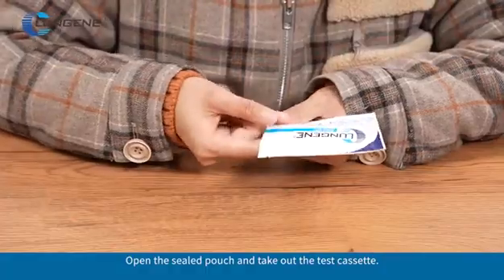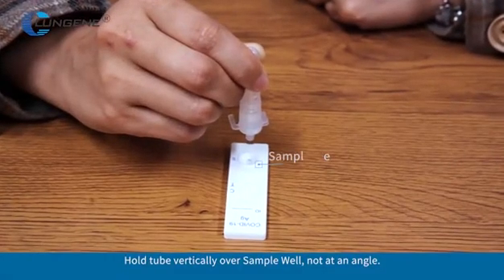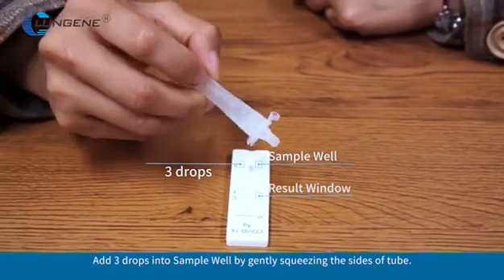Open the sealed pouch and take out the test cassette. Hold the tube vertically over the sample well, not at an angle. Add 3 drops into the sample well by gently squeezing the sides of the tube.